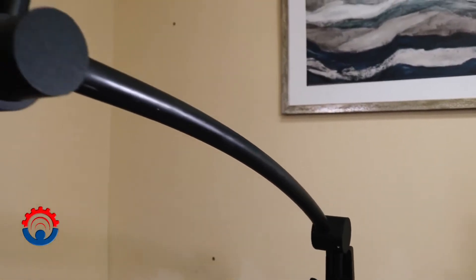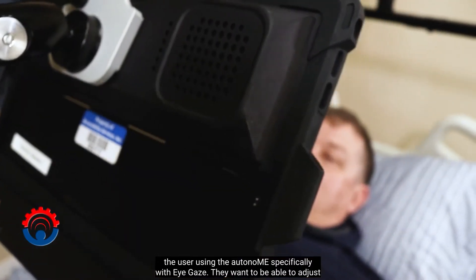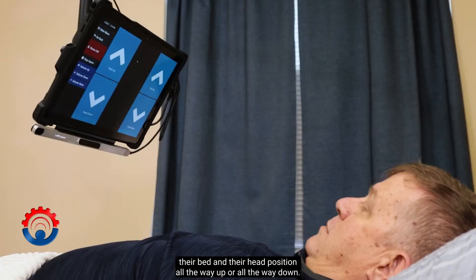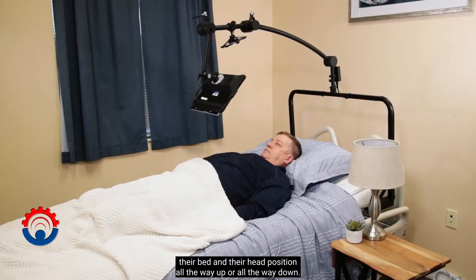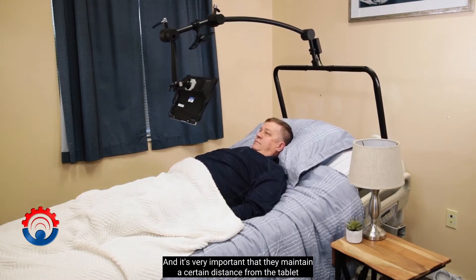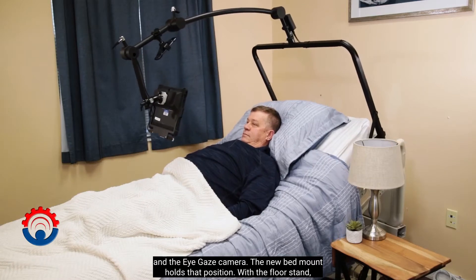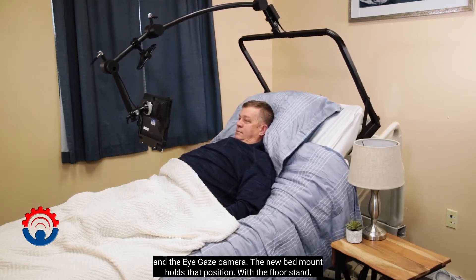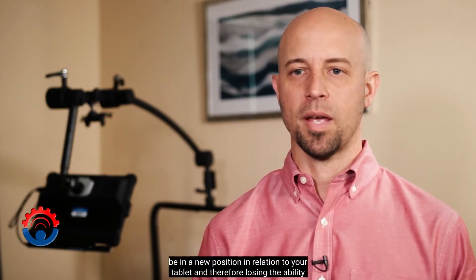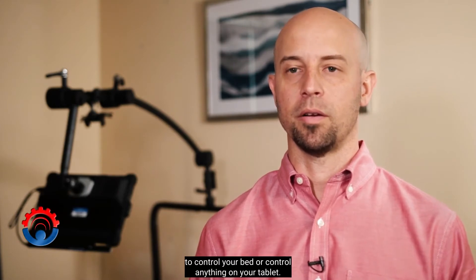With the new bed mount, we've provided more independence to the patient using the autonomy, specifically with eye gaze. They want to be able to adjust their bed and their head position all the way up or all the way down. It's very important that they maintain a certain distance from the tablet and the eye gaze camera, and the new bed mount holds that position. With the floor stand, you would move your bed and then be in a new position relative to your tablet, therefore losing the ability to control your bed or anything on your tablet.